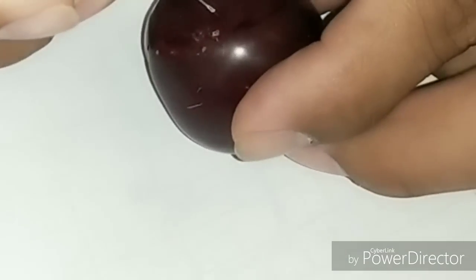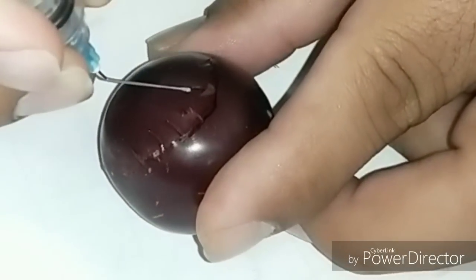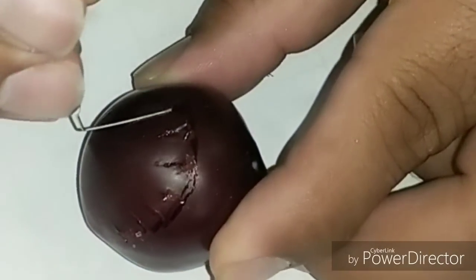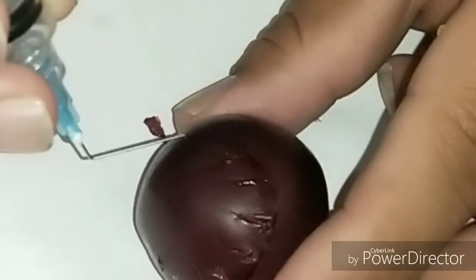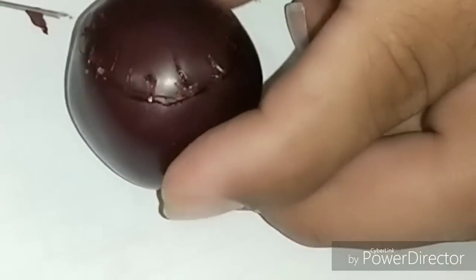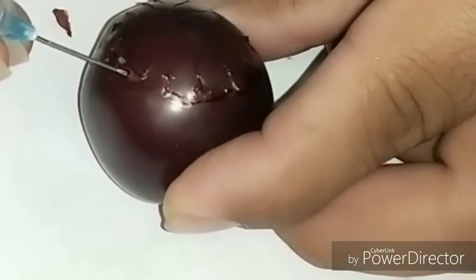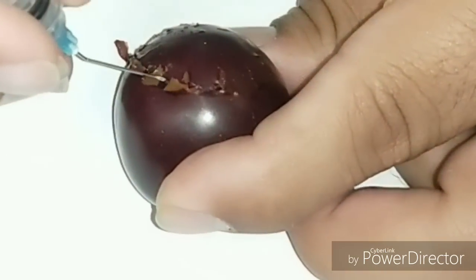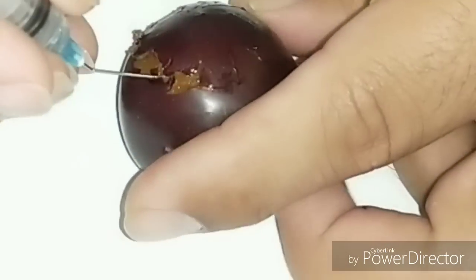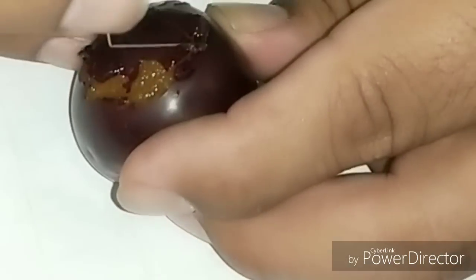You can also learn capsulotomy and capsulorhexis on a plum. Since the plum capsule is hard, you should use a cystotome made from a 5cc needle. Give vertical tears into the anterior capsule 360 degrees and then connect each one with the next — that is how you perform anterior capsulotomy.